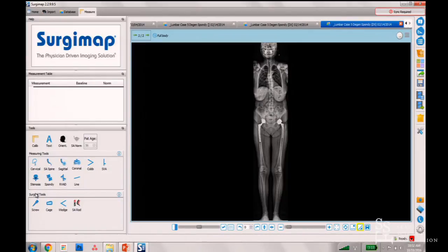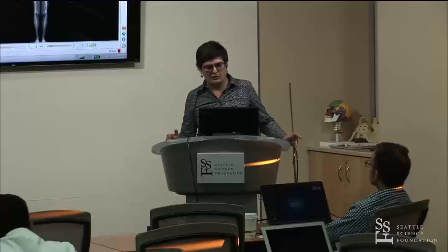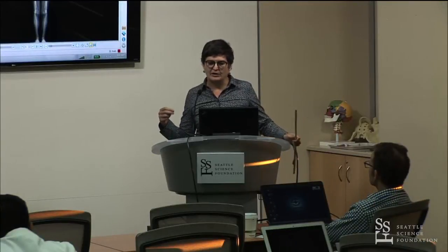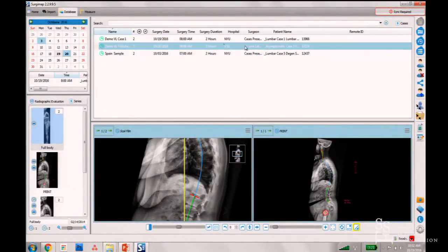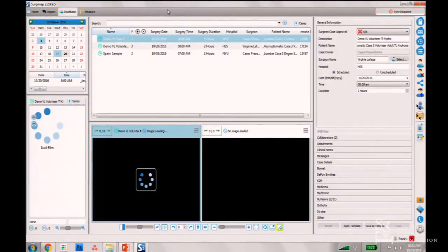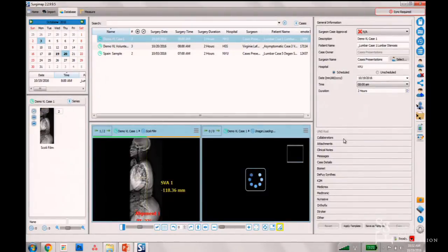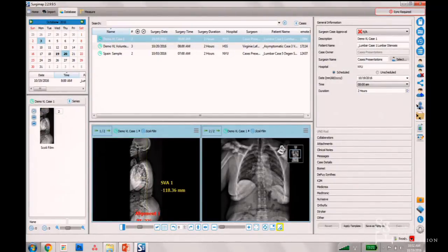Perhaps what's even more important is that you can share everything. You can create a case and share all the information. In my database, collaborators who have access can see the image, measurements, and surgical planning. This can be viewed either in the software, on the app, or online.